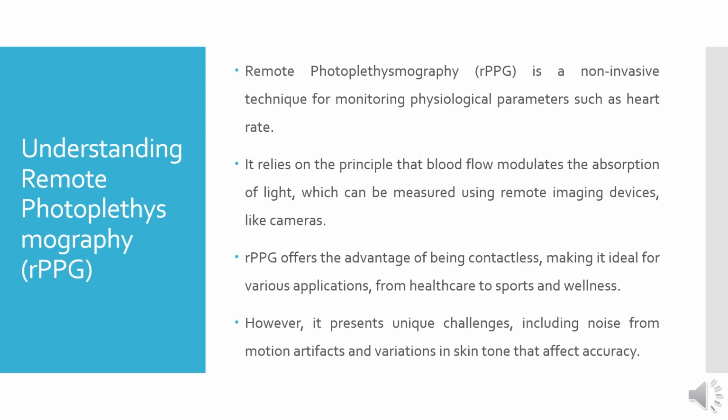rPPG offers the advantage of being contactless, which basically makes it ideal for various applications from healthcare to sports and wellness. However, it presents a unique challenge. It includes noise from the motion artifacts, as well as the variations in skin tone, which can affect the accuracy.